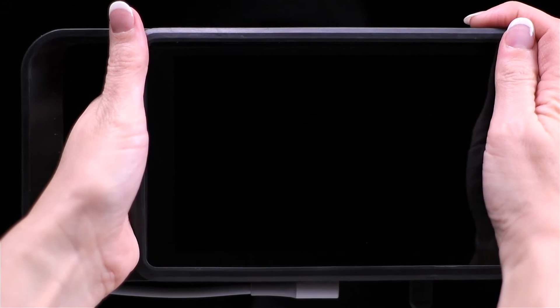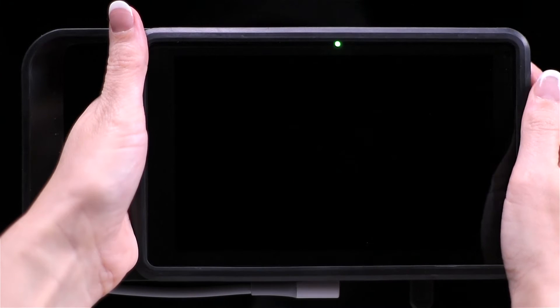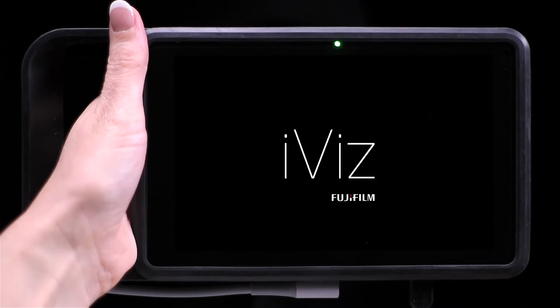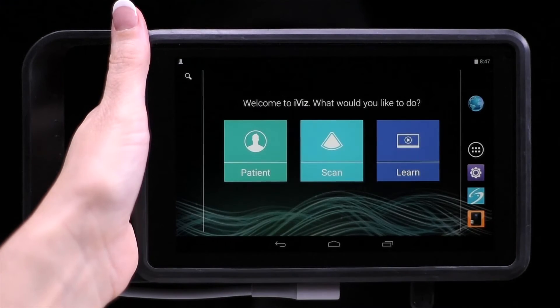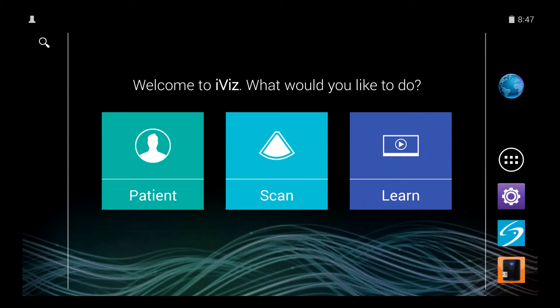Now let's turn on the system by pressing the power button. The green light indicates that the system is powering up. When the day and time appears, swipe the lock icon up and the iViz home screen appears.